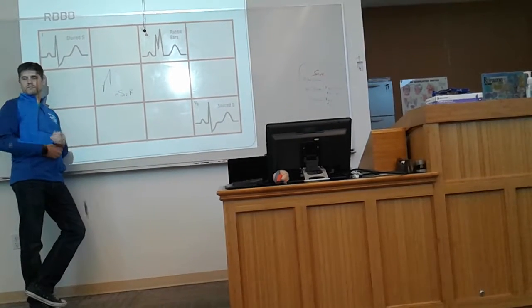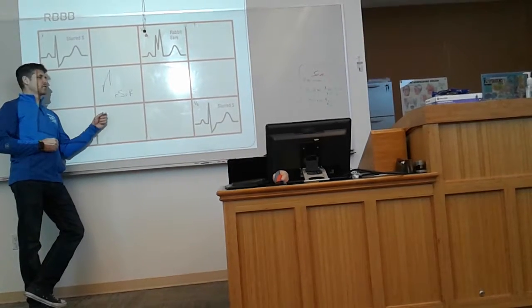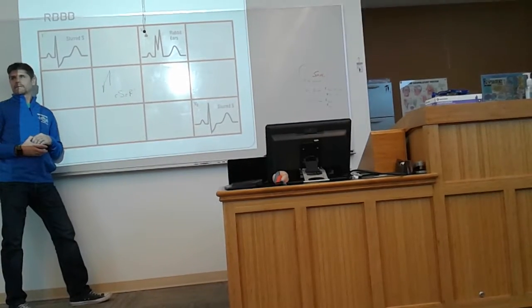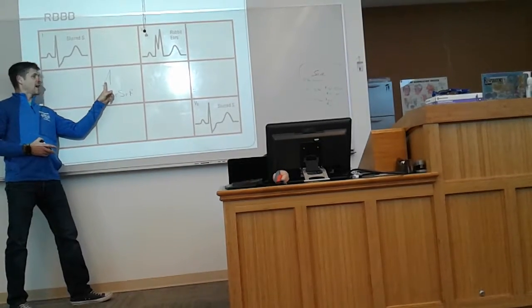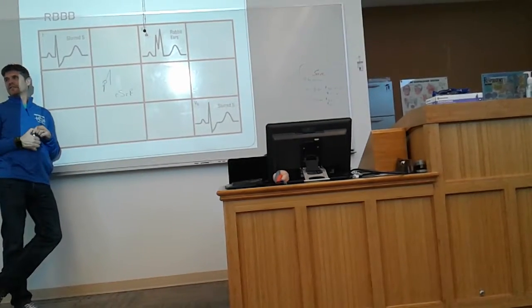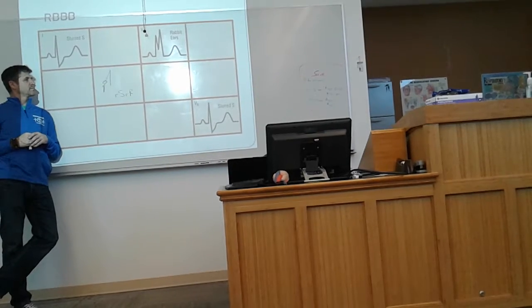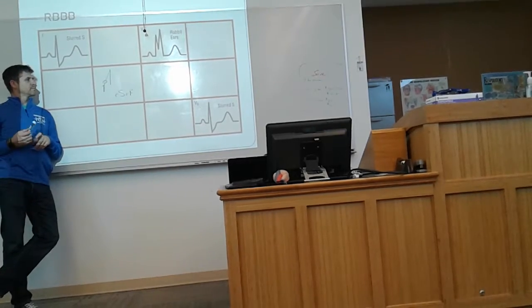So, what's the difference again between lowercase r and uppercase R? What's the difference between our lower cases and upper cases? Relative size. Because you can almost see the second R, we're saying is a small r because it's not as big relative to that big R. This R right here is not very big. So imagine if you took that exact same thing, but brought it down like one box and back up, it'd still be a small r, where this just doesn't have any downward deflection to it at all. So it's still a small r. All right?